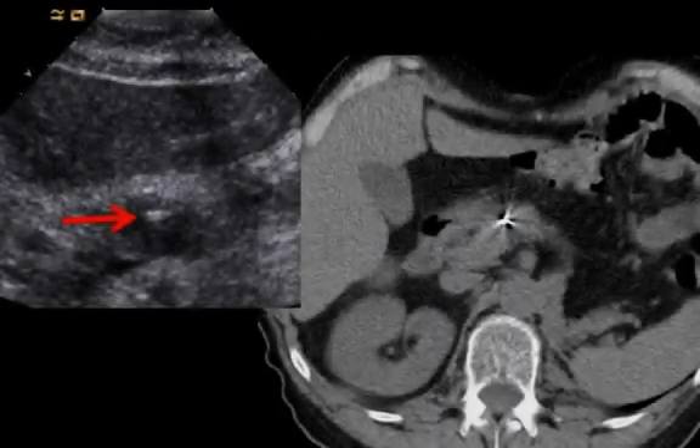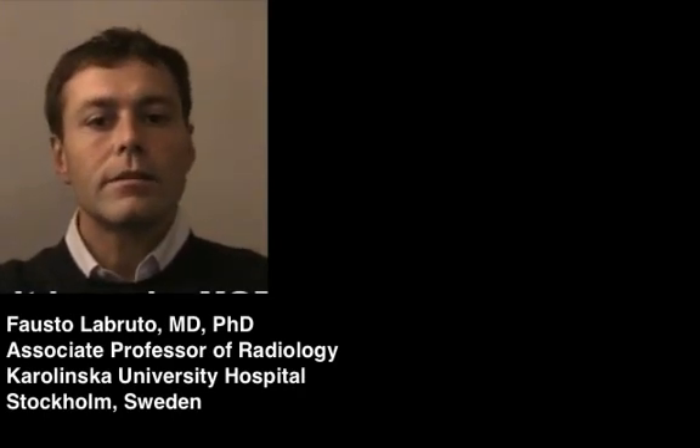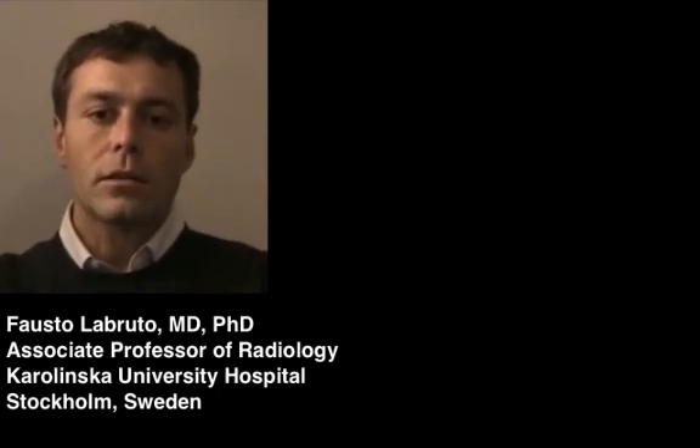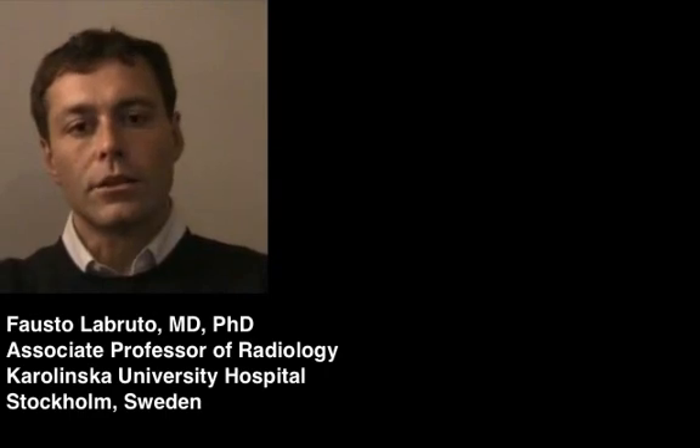As you can see from the still images, the Gold Anchor is visible on both ultrasound and CT scan. It is actually easier to deliver a gold marker than to take a biopsy — for a biopsy the needle must be in the lesion, whereas for delivering a gold marker it just has to be in the vicinity of the lesion.